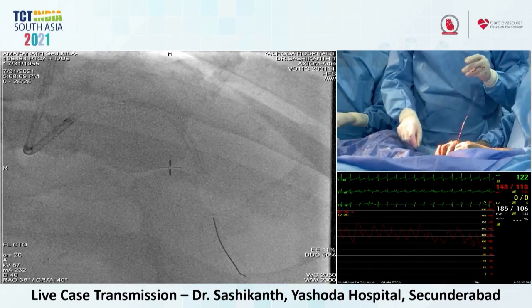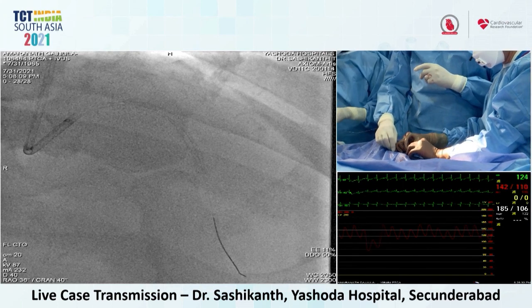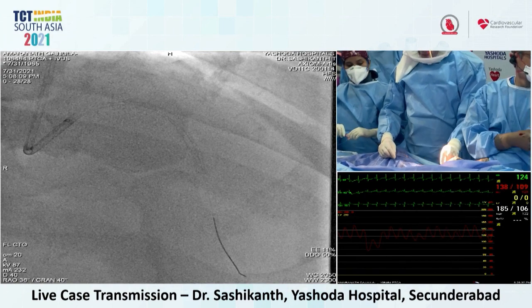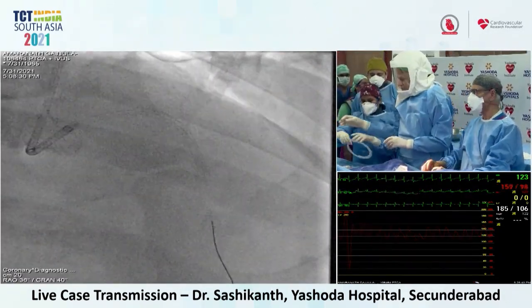Is it a proximal dissection? Talk to the patient. So how is he? Yes, sir. So your next step will be to go with IVUS to check now.